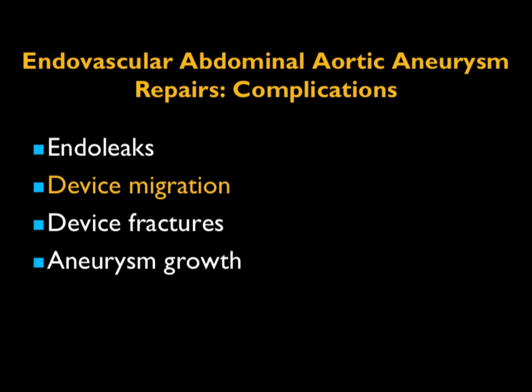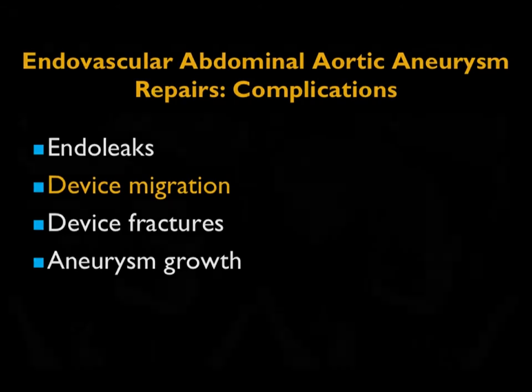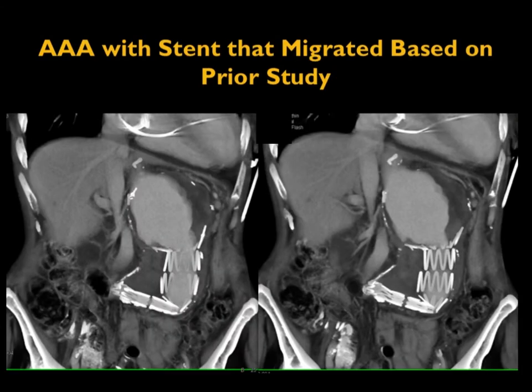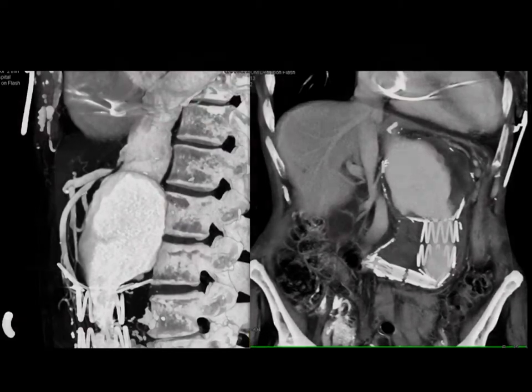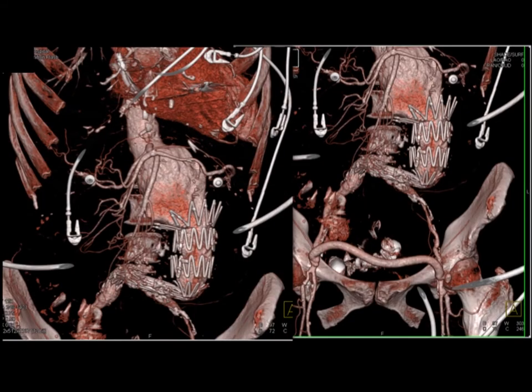Device migration is usually identified by comparing multiple scans over time. Here is a good example where the stent has migrated distally, impacts on itself, and you can see the stent has failed with sharp angulation — shown in 3D and with volume rendering, a beautiful example of stent failure.